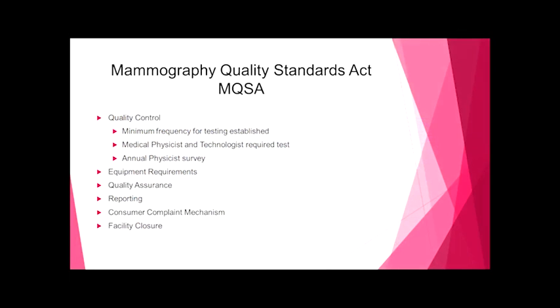So the other components of the Mammography Quality Standards Act that you're going to see, regardless of the kind of program, whether it's mammo or CT or MR, they're going to have quality control. They have minimum frequency for testing established, both for the medical physicists and the technologists in the mammography programs have required testing in addition to the annual physicist survey.